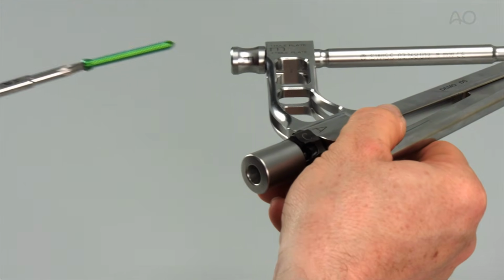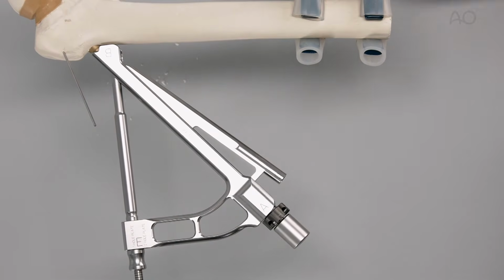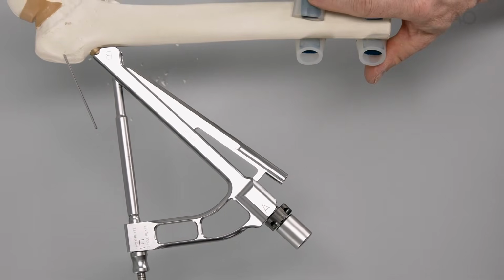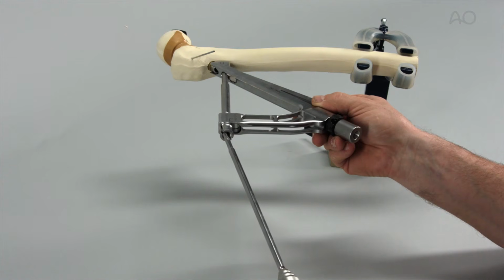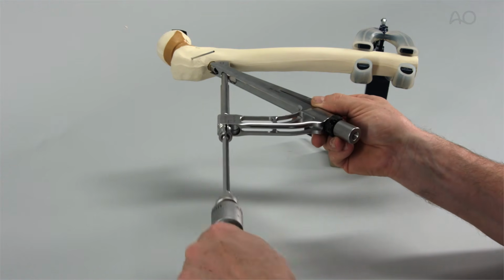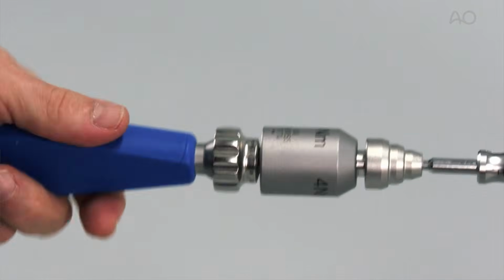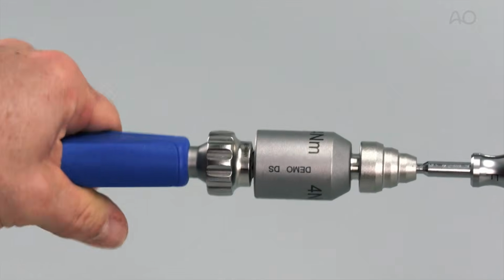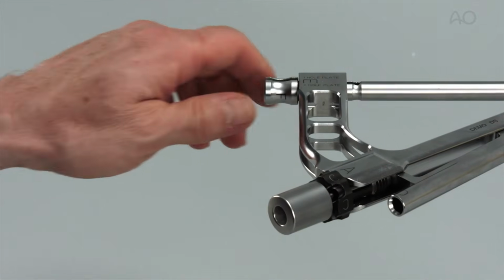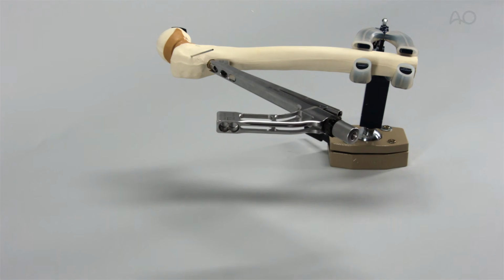The locking screw is initially inserted under power, and final tightened with the 4 Nm torque limiter. An audible click is heard when the screw reaches the 4 Nm limit. The protection sleeve is removed by pressing the head of the sleeve together while pulling.